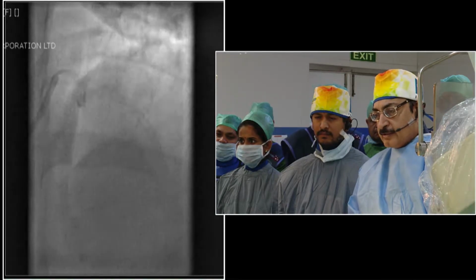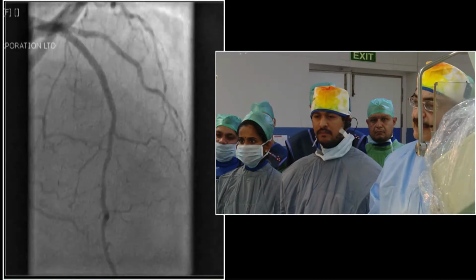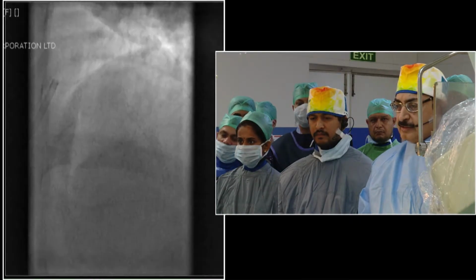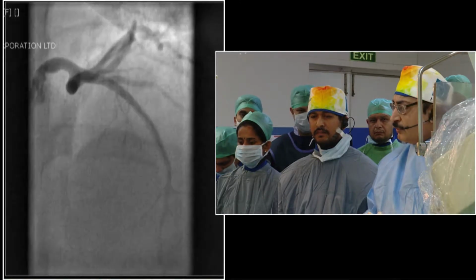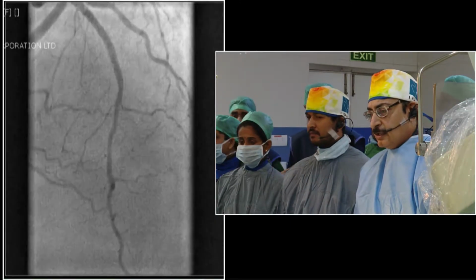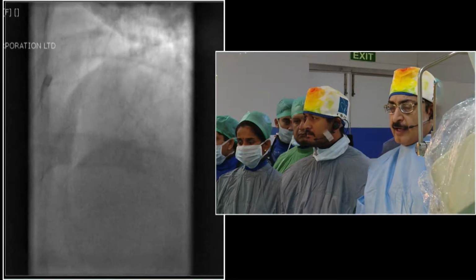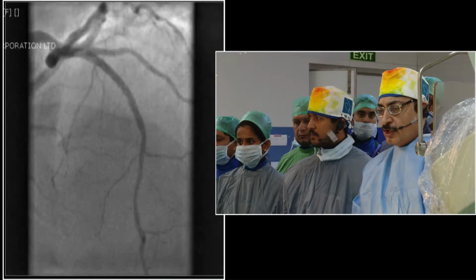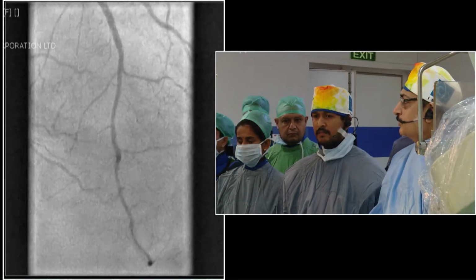So this was the final result which we had achieved after the angioplasty. Today we have done the FFR because we wanted to assess the left main stenosis and also the ostial LAD stenosis, and also to see the apposition of the stent which we placed the other day. I have Mr. Farzan with me, who will be discussing the OCT. The FFR here was 0.95 after the angioplasty, so the proximal or ostial LAD and distal left main disease is not significant, and we are not going to be handling that. Over to Mr. Farzan.